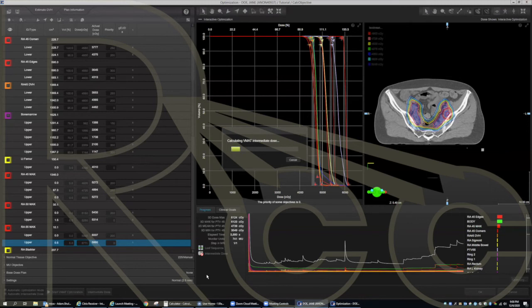Any other thoughts or comments? We talk about other sites as well. Anything that wasn't clear? Oh, it's all good. Actually, like you said from the beginning, setting up the contours is so important at the beginning, because you never left this optimization going back and thinking, oh, I need to create this other contour to fix this and that. So you have everything. It's just a question of fine tuning and knowing what you're doing. So that's really important, I think.